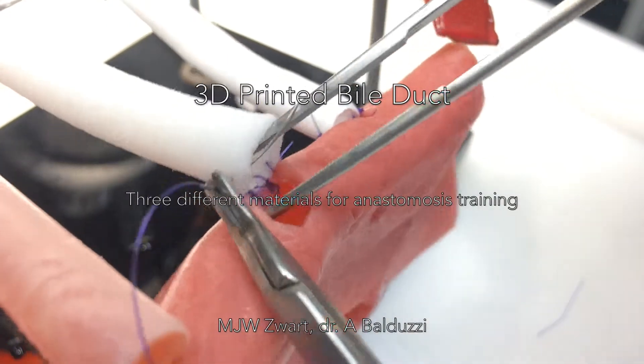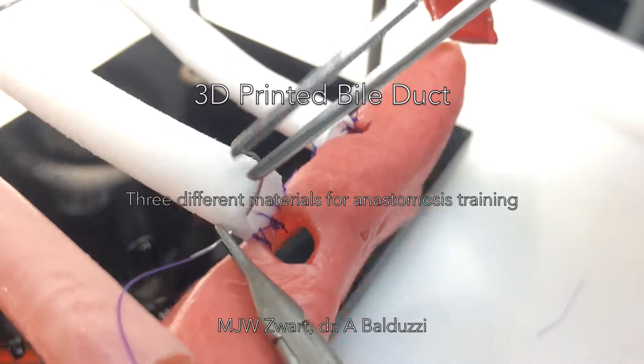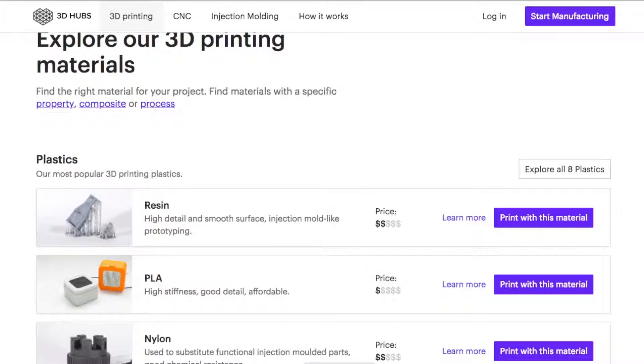This is a review of three different materials for anastomosis training. We use these materials to minimize the use of animal models.